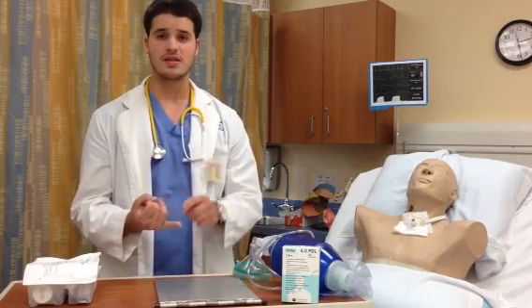The objective of trach care is to maintain a patent airway and skin integrity, and to prevent infections and displacement of the trach tube. Indications are any patient with a trach tube needs trach care. Contraindications are any patient with unstable vitals. If the patient has hypoxemia, you might want to hold off on suctioning the patient. The hazards are any signs of respiratory distress, atelectasis, bleeding, desaturation, hypoventilation, hypoxemia, and tachycardia.